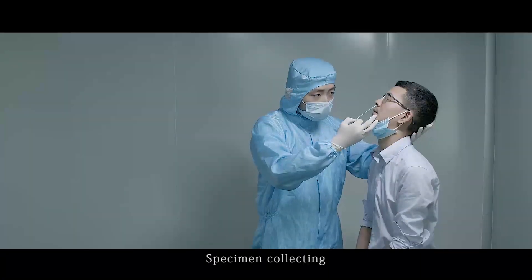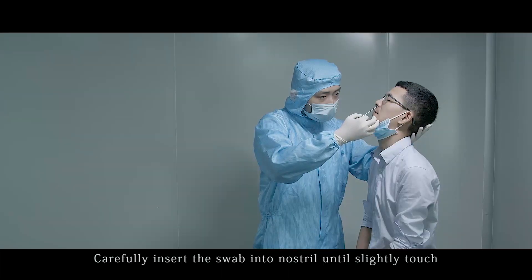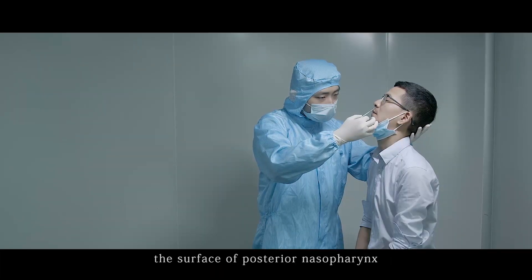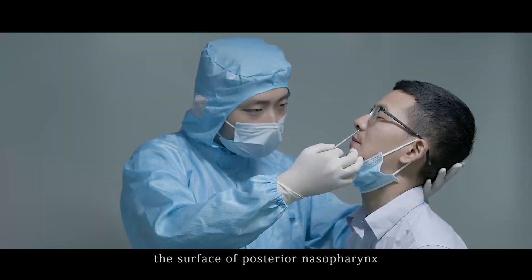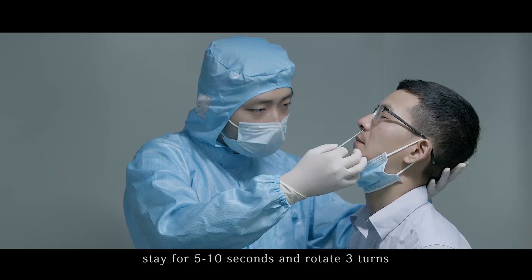Specimen collecting. Carefully insert the swab into the nose until it slightly touches the surface of the posterior nasal passage. Stay for 5 to 10 seconds and rotate 3 turns.